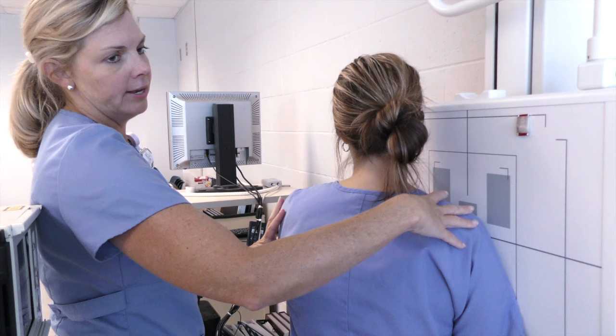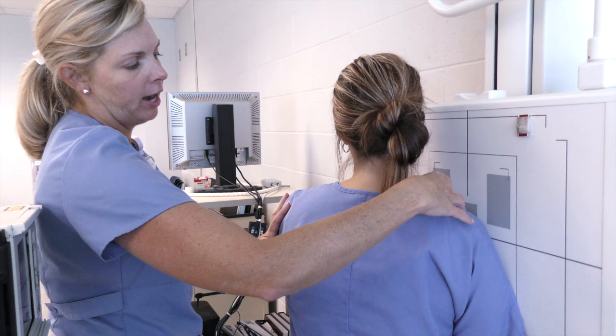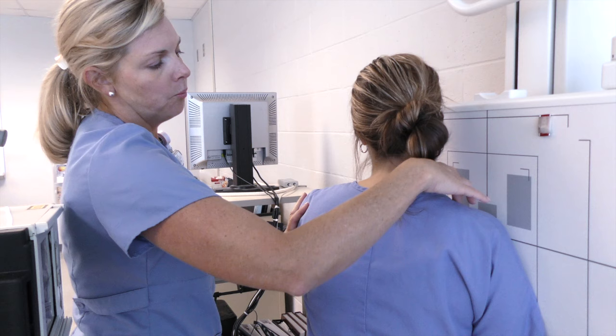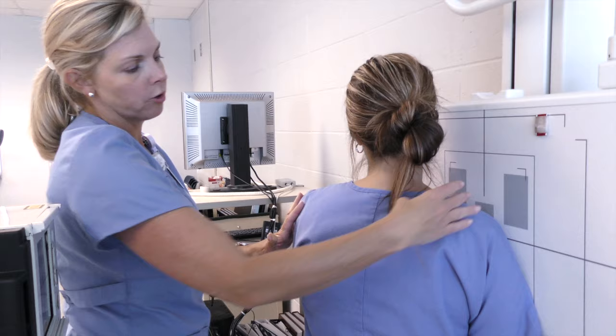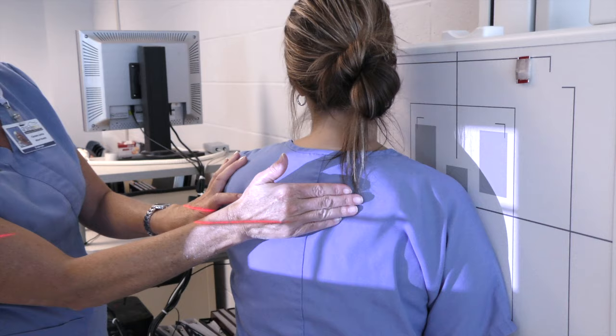For the scapula Y view, we're going to move our shield and turn the patient around — we'll do the PA instead of the AP. You want the centering to be with your AC joint and the superior angle of your scapula. Palpate these two areas and make sure they are perpendicular to the board.